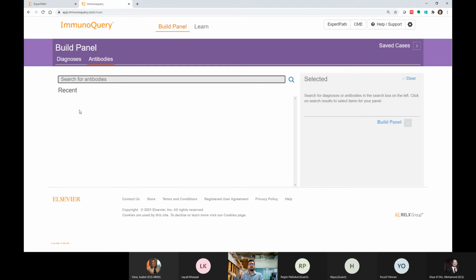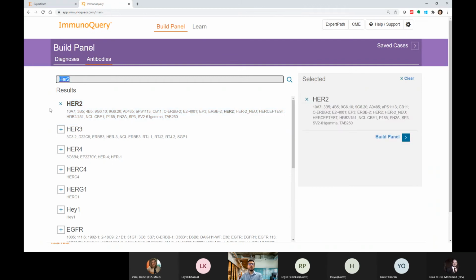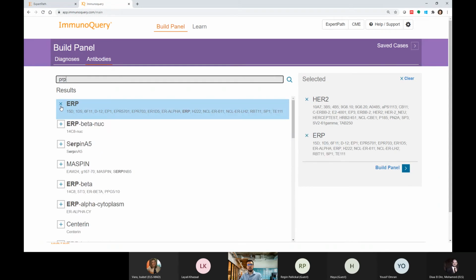So the question here, I believe, would be, if I'm doing a panel for normal analysis, a standard panel is a very used panel in immunohistochemistry to select or rule out some kind of condition or confirm one. And I have an expected result. So I'm going to use a very frequent breast cancer panel, or screening panel, that we use, with the marker HER2 for the genetic mutation, and then the markers for estrogen and progesterone.